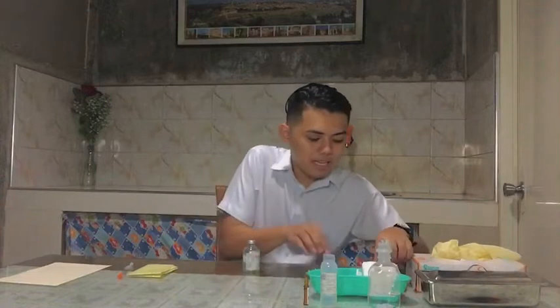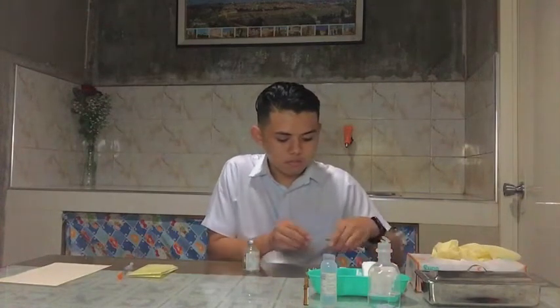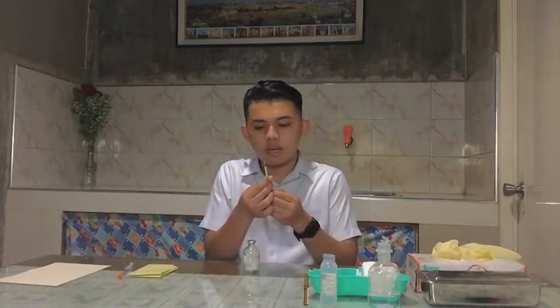Then, as I have said earlier, carefully insert the needle into the upright vial through the center of the rubber cap, maintaining the sterility of the needle to avoid any contamination. So here, let's assume that we will be getting 5 ml.